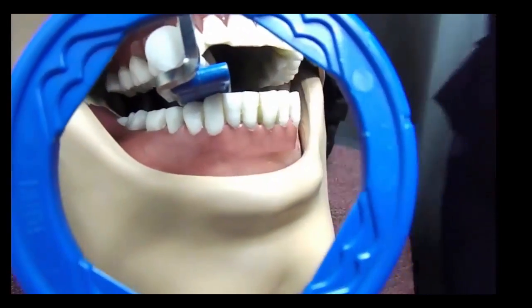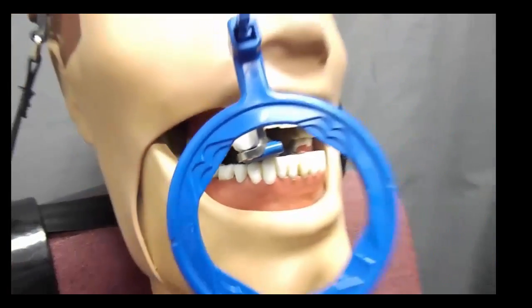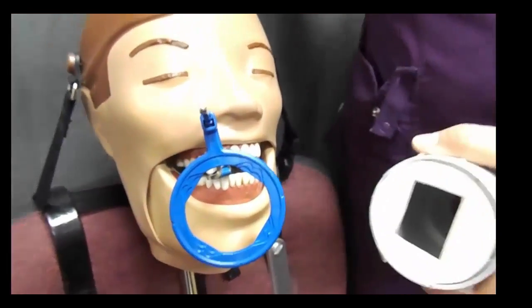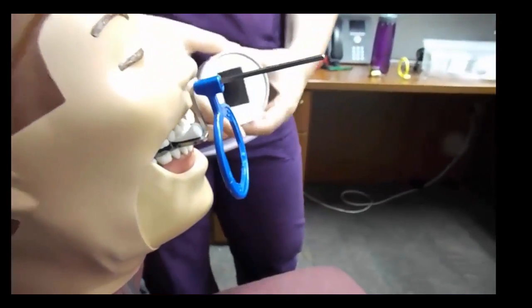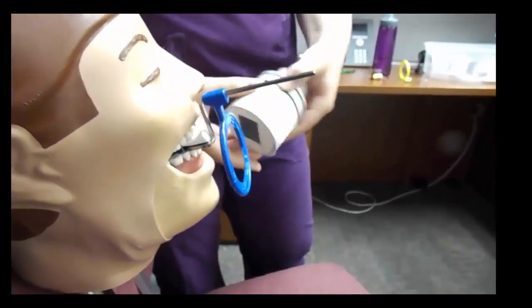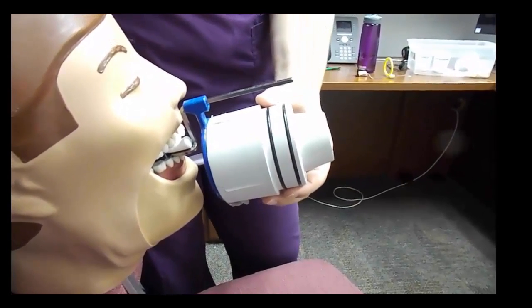Slide your ring in about an inch from the patient's face. Again, check the end of your tube at the collimator to make sure your square matches up with the phosphor plate. Align your tube so it is nice and flush with your ring and make sure your notches are aligned.